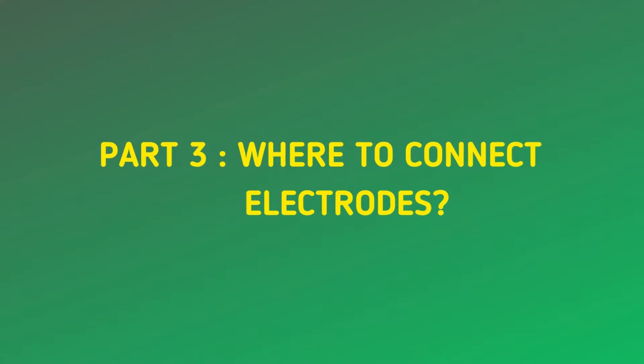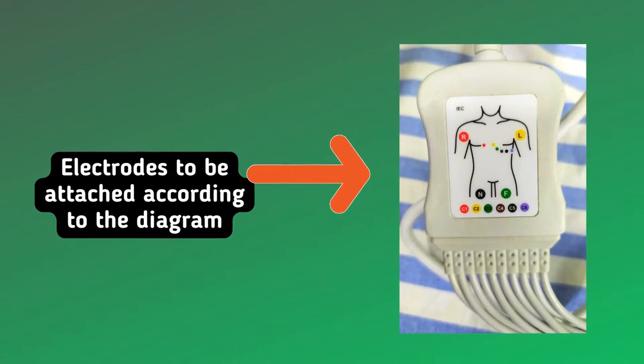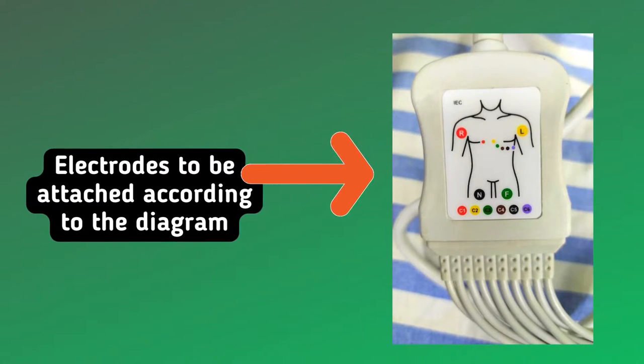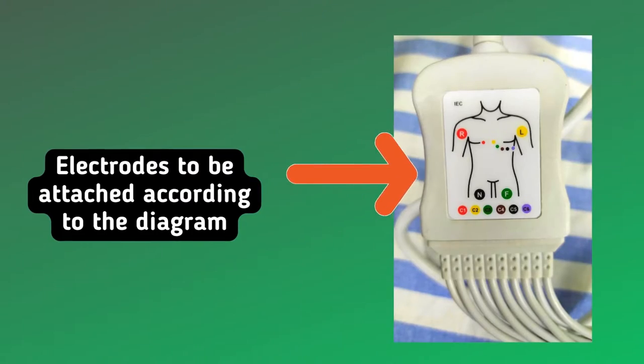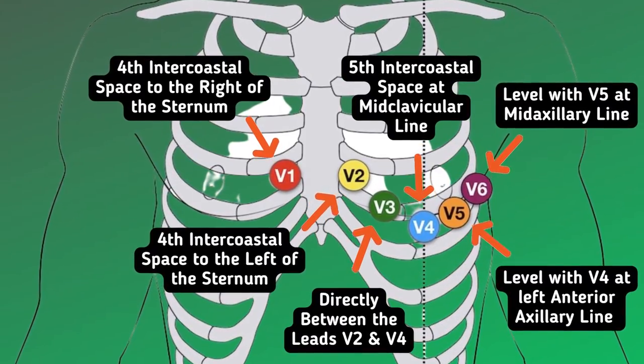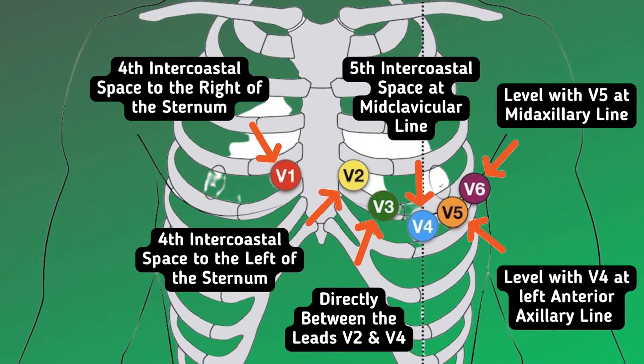Part 3, where to connect electrodes. Electrodes to be attached according to the diagram. V1 is the fourth intercostal space to the right of the sternum. V2 is the fourth intercostal space to the left of the sternum.